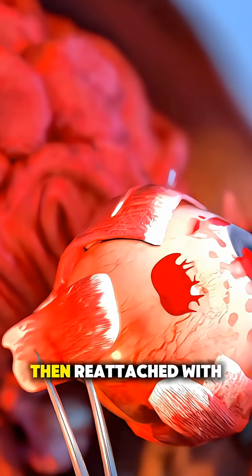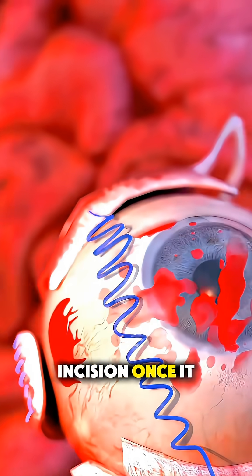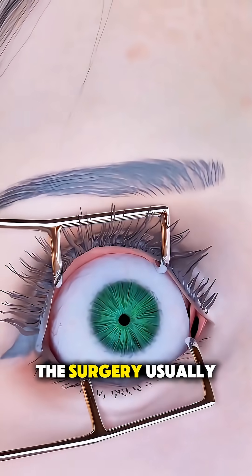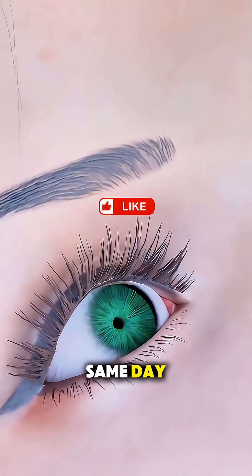The muscle is then reattached with fine dissolvable stitches, and no one can see the incision once it heals. The surgery usually takes about an hour, and most people go home the same day.